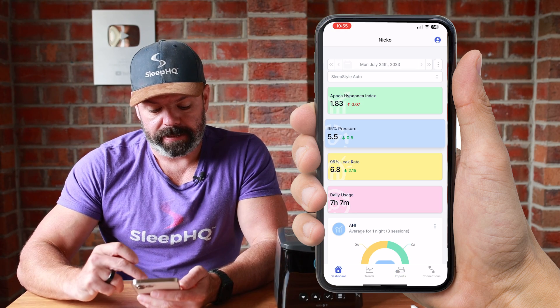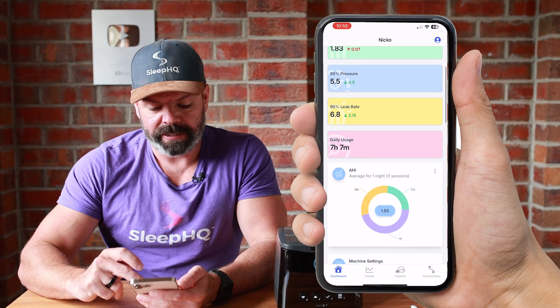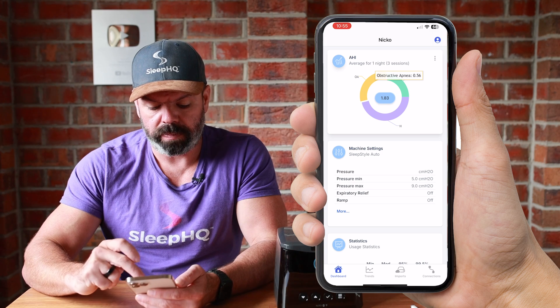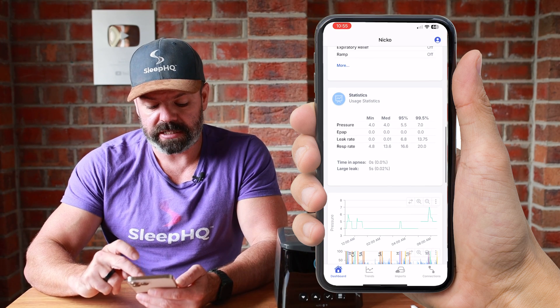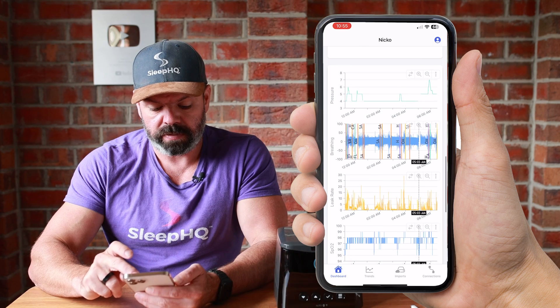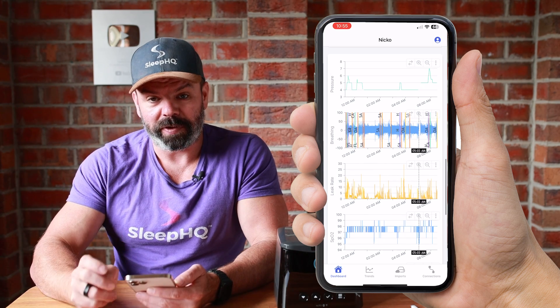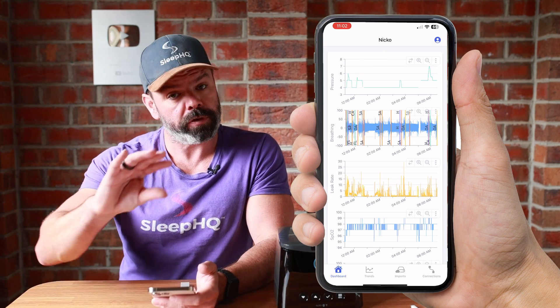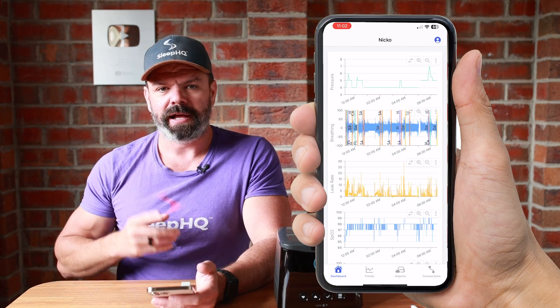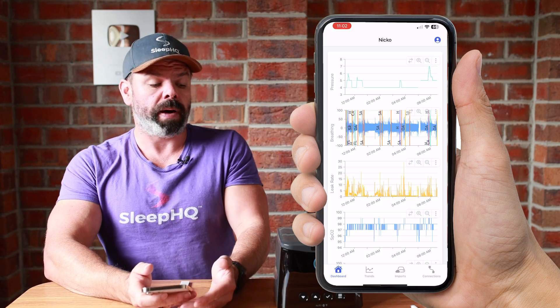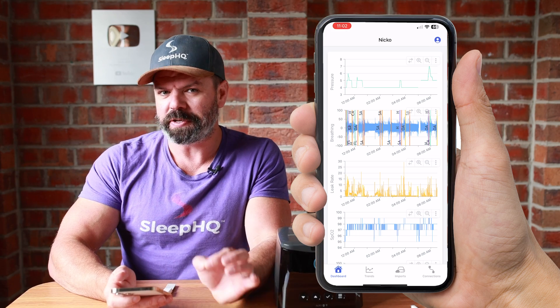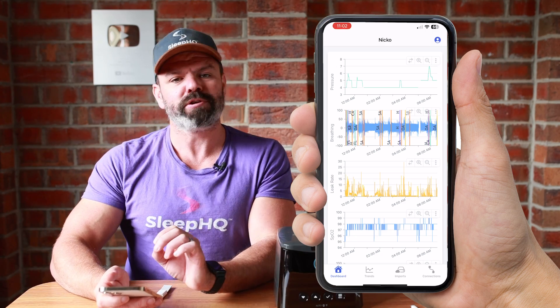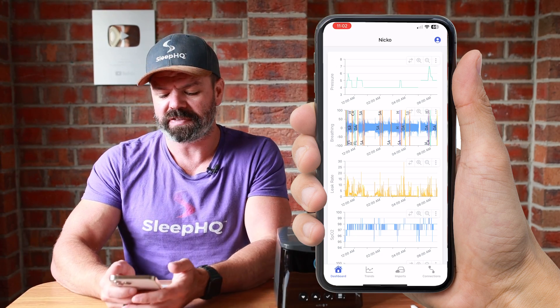Once it's done, here's all our data. We've got a breakdown of all the different events: obstructive apneas, central events, hypopneas. We've got our machine settings and statistics. But the good stuff is when you scroll down — you can see the pressure trace, showing how the automatic algorithm adjusts pressure delivery through the night in response to your breathing data. That's the power of SleepHQ and what sets us apart from the beginner apps. We have every single breath throughout the night, every hypopnea, every apnea flag, and with this device we also get the sensor wake flags and airflow limitation flags.